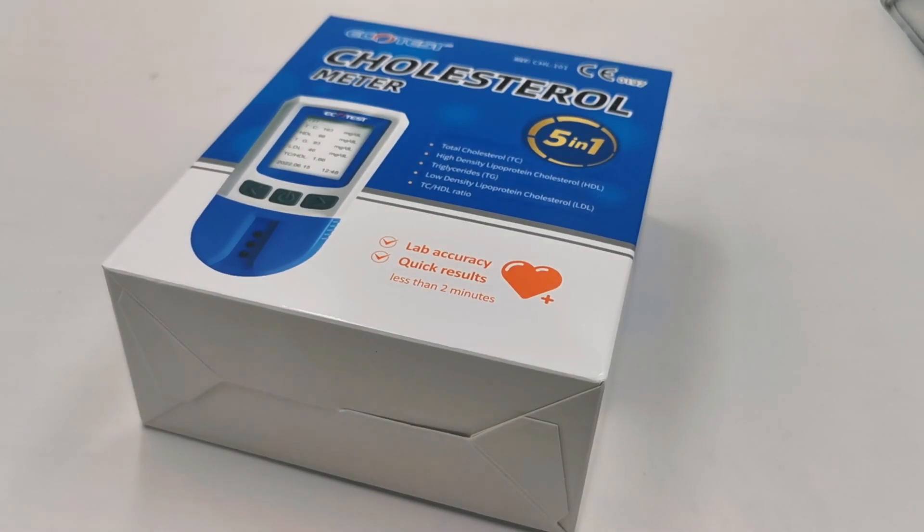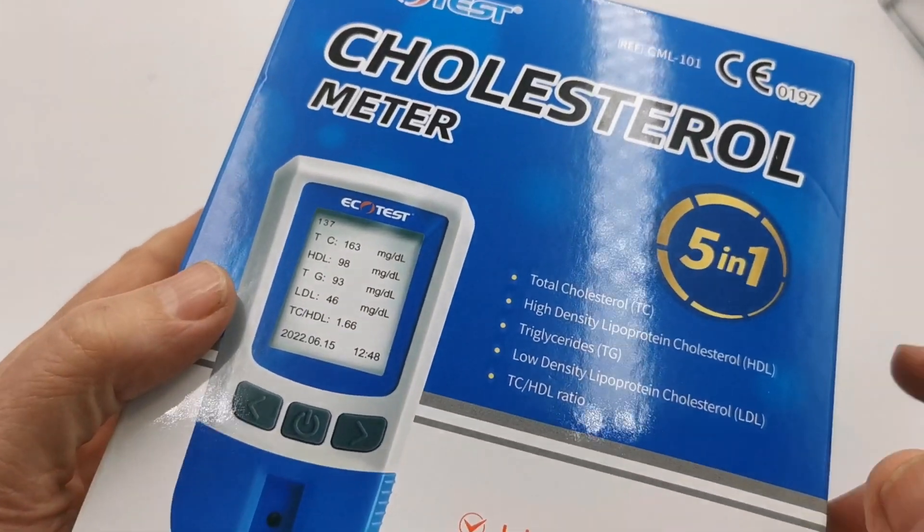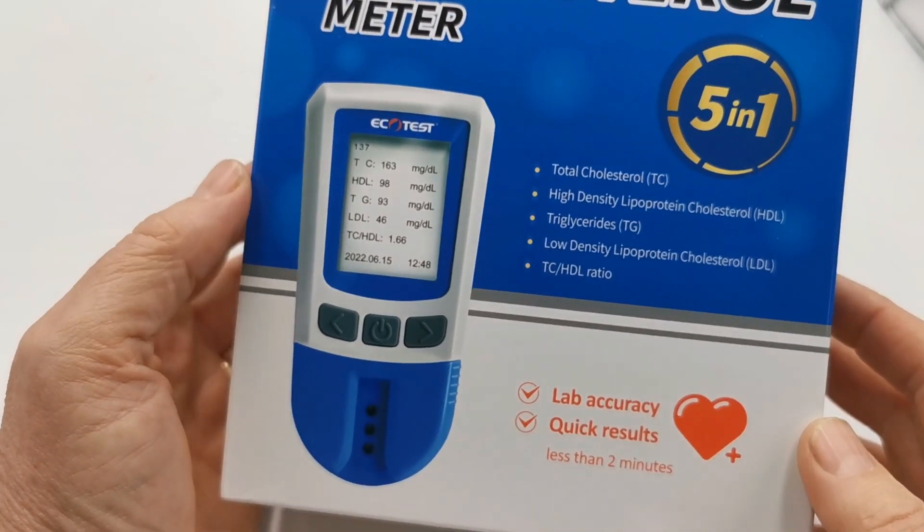Welcome to this Valumet presentation video for the Ecotest Cholesterol Meter System. This is the box pack. You can see that it has CE0197 certification for self-testing or home test use.